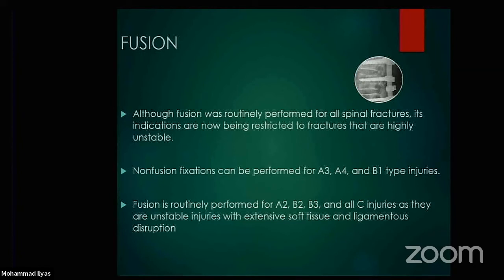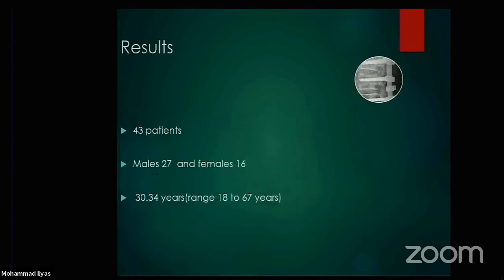Non-fusion fixation can be performed for A3, A4, and B1 type injuries. Fusion is routinely performed for A2, B2, B3, and all C injuries, as they are unstable injuries with extensive soft tissue and ligamentous disruption.